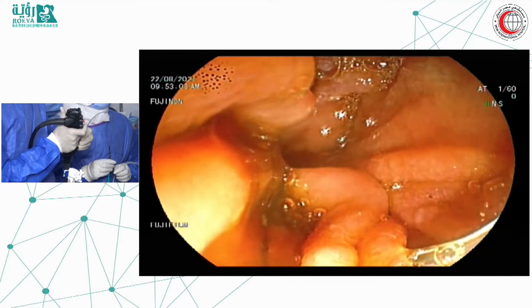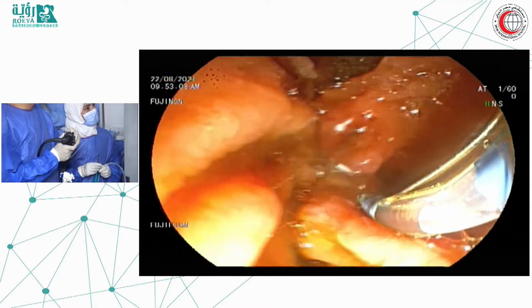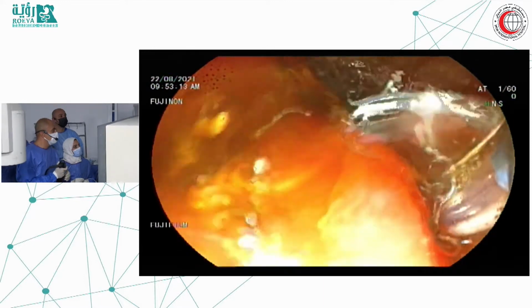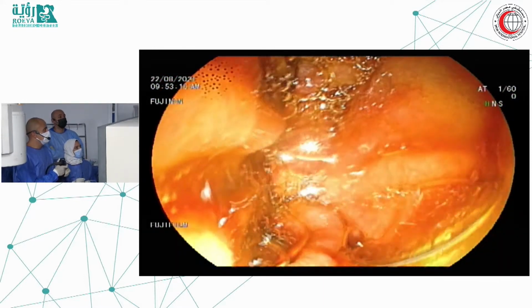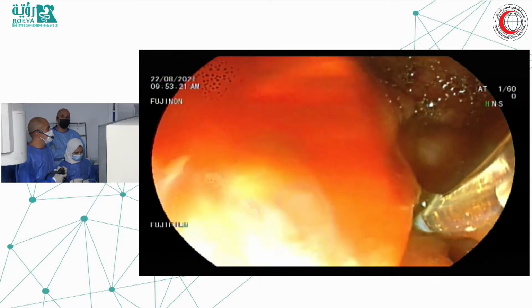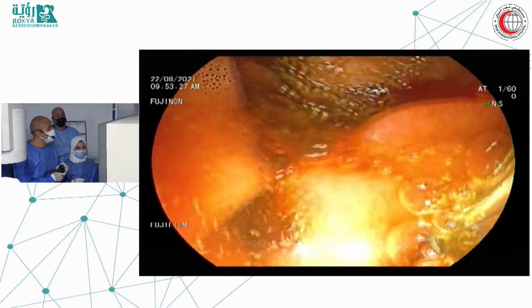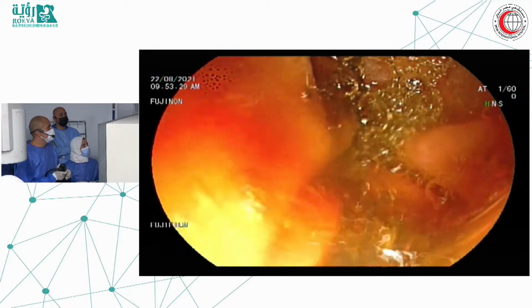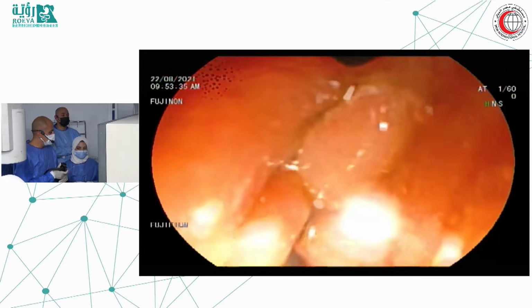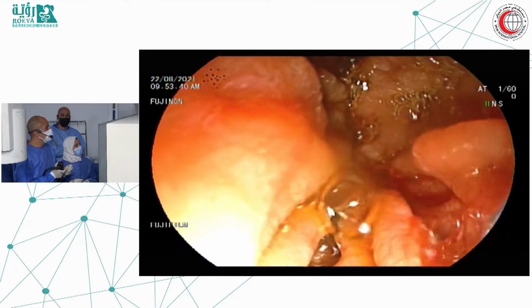So what do you think about the idea of doing RFA in this patient, where we don't really know the origin or the nature of the structure? I think it's a point that many of the viewers might think is arguable or debatable, that you do RFA and you still don't have a definite pathology. But actually, what supports this is that, of the many studies that have been done on RFA, the safety profile is excellent. The reported complications of RFA are minimal.